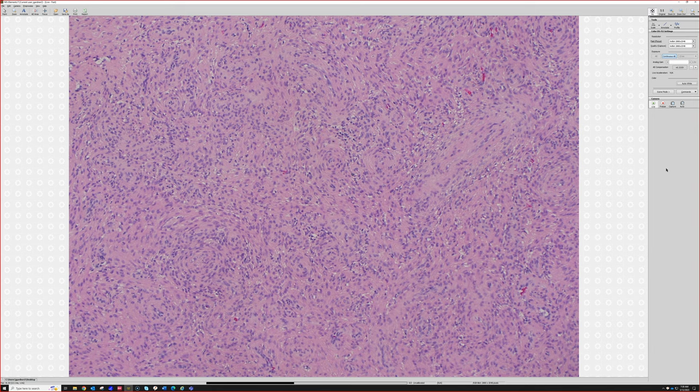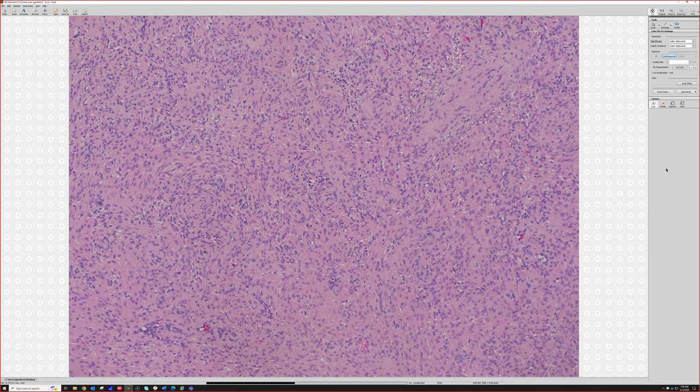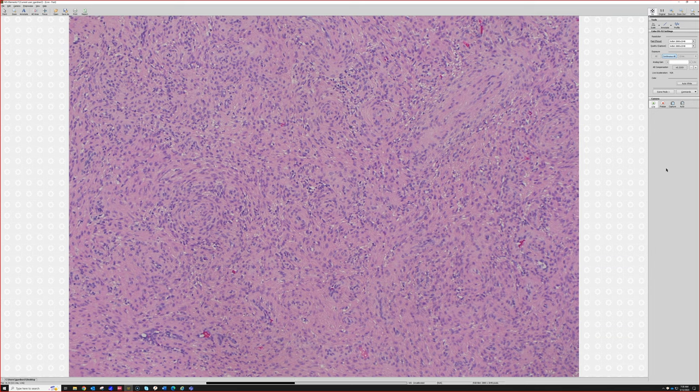So any thoughts on what you'd do with this area? If I just had the previous area I showed you, I think that's exactly what I'd call it. I have a slightly different view with this, but there's a lot of morphologic overlap. See how it looks kind of whorled? You guys see that? Whirling is something you've got to hallucinate a little bit, but there's a whirl, a whirl, a whirl. Whirled and swirled, plump, pink spindle cells. Sometimes they're a little more bluish than this. Sometimes they look more pink, depends on the case.